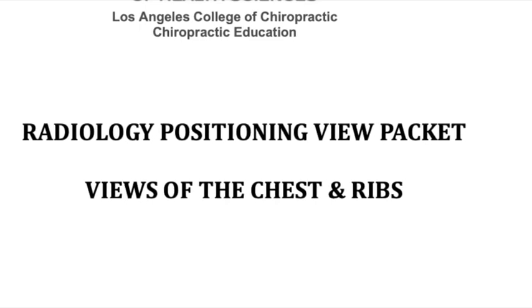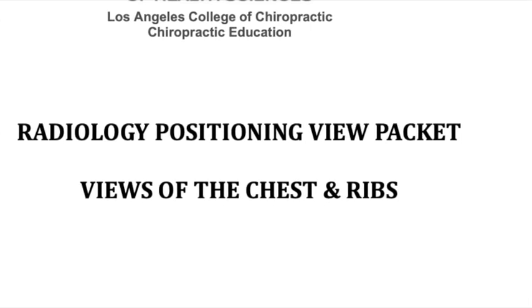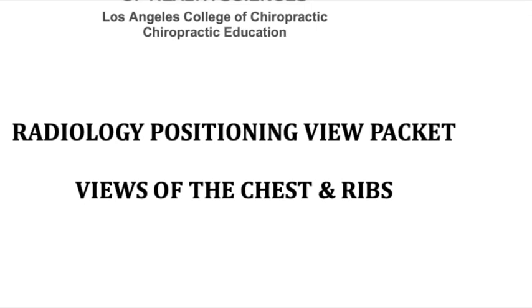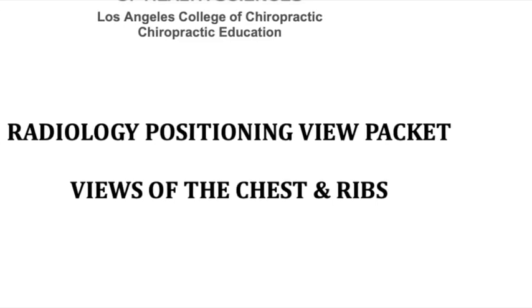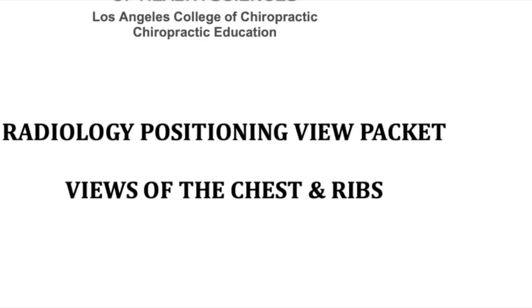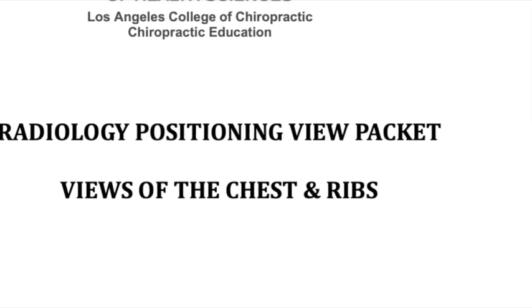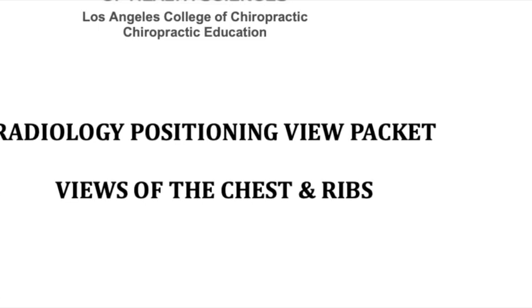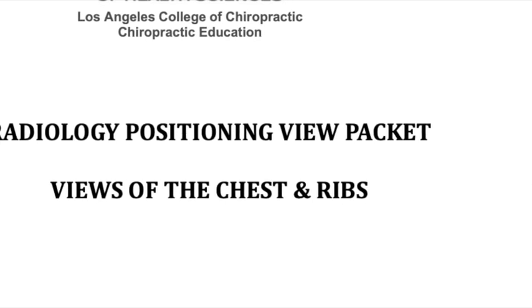We use a 14 inches by 17 inches chest cassette, with a grid and bucky, at 120 kVp. Collimation should ensure at least 3 sides are visible on the radiograph, fulfilling the evaluation criteria. Patients should be instructed to suspend respiration after a full inspiration to visualize subtle lung anatomy. Gonadal shielding is mandatory for radiosensitive tissues outside the region of interest. The evaluation criteria for a successful apical lordotic chest view include the complete visualization of both lung fields, including the apices and clavicles.